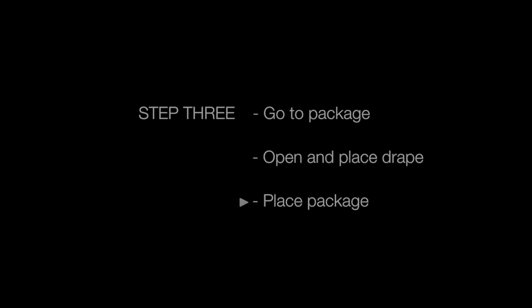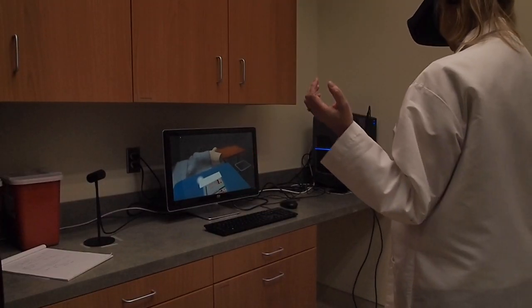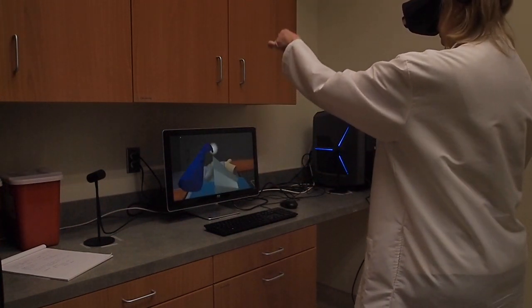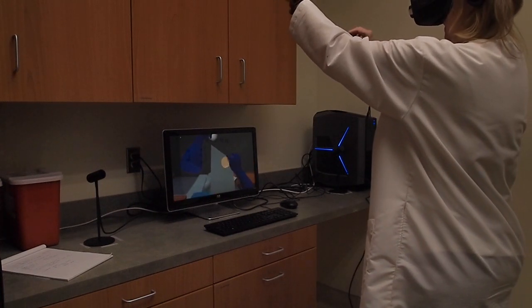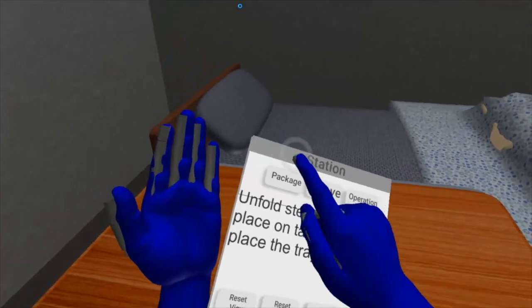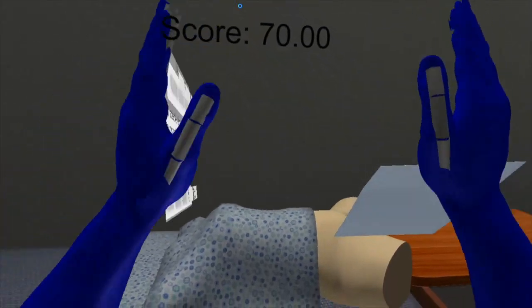Now we will press the package button and place the sterile drape. Lift the sterile drape straight up for the patient, grab the second tab, and it is put into place. Pull straight up on the first tab, then the second.